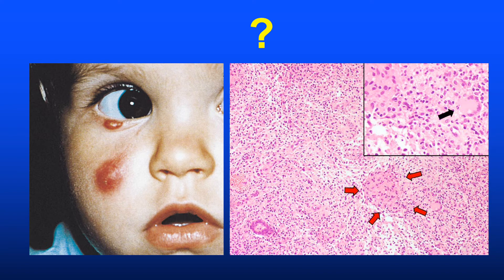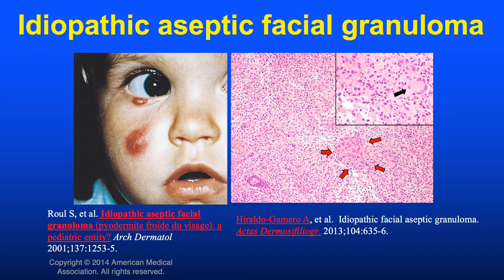Here's one for the pediatric dermatologists. In the photomicrographs we have granulomatous inflammation with scattered lymphocytes, a neutrophil (black arrow), and possibly some eosinophils — granulomas with a number of other inflammatory cells, classifiable as either tuberculoid or suppurative granuloma. These are examples of idiopathic aseptic facial granuloma, regarded as a unique expression of childhood rosacea with one or a small number of inflammatory nodules. Fortunately, this condition is self-limited.